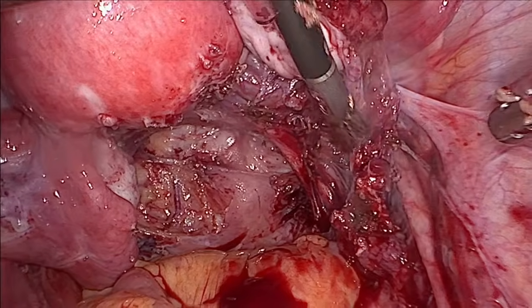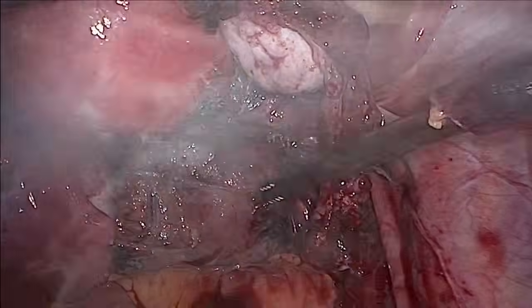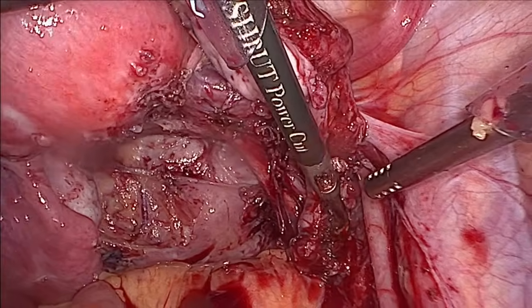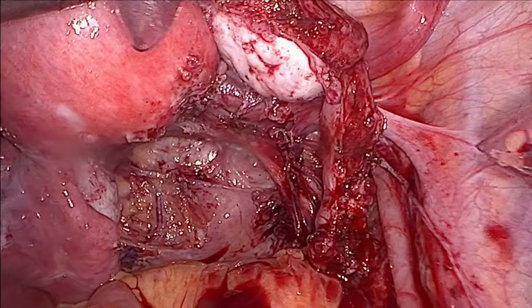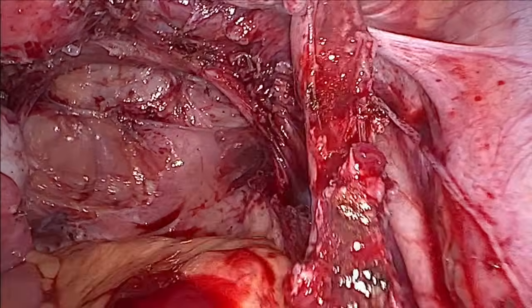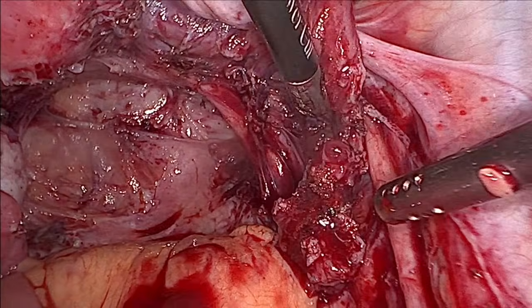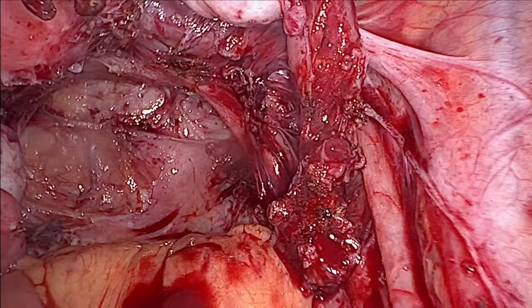This has happened because of the kinking, long time kinking. So the tubes otherwise look healthy, there is no hydrosalpinx in them. So in my opinion we can actually wait and just do this test a bit later, or we can also do it sometime else.